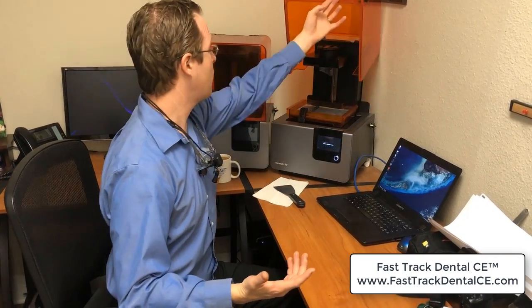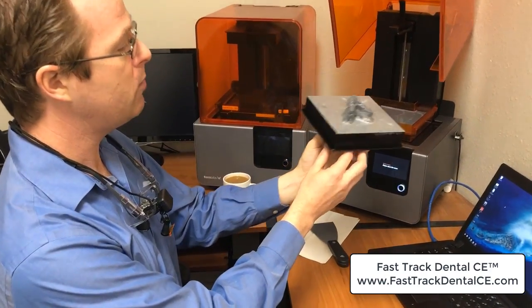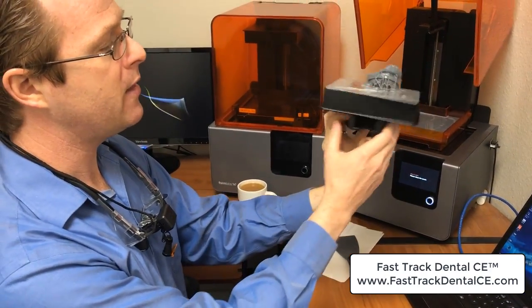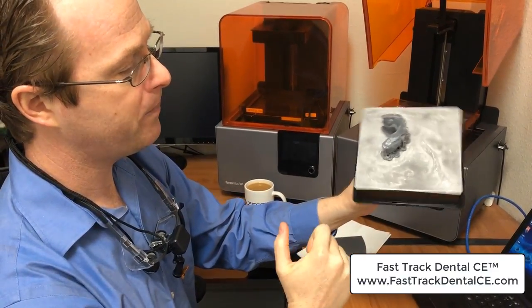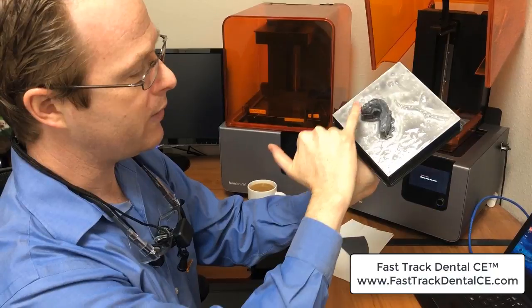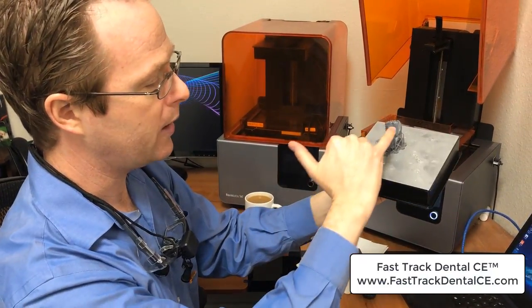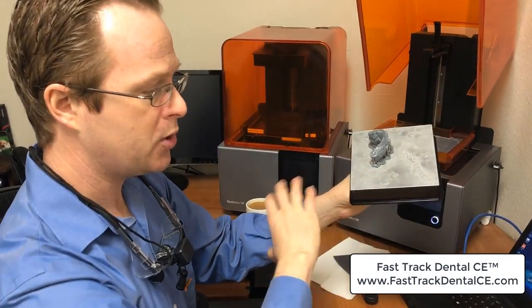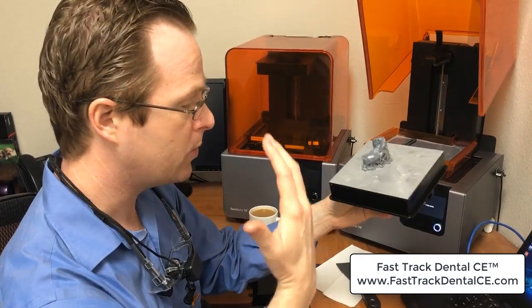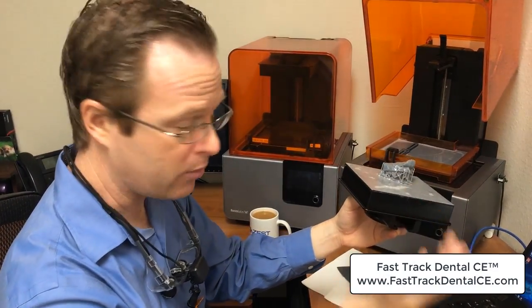I came into my office this morning and found that something I had 3D printed overnight had failed. My model looked fantastic from one side, but when I turned it around you could see it just sheared right off. The full model was a full hybrid — an opposing model for some laboratory work. I had it in all the normal positions, made sure it was in line with the wiper, made sure it was well supported, and even used supports, yet I still had a print failure.